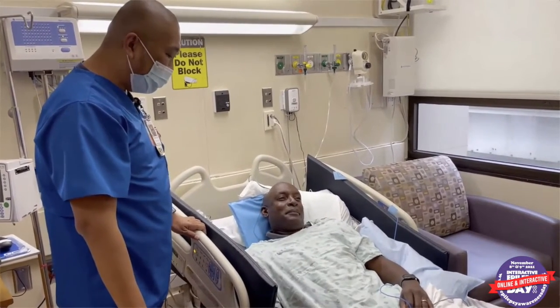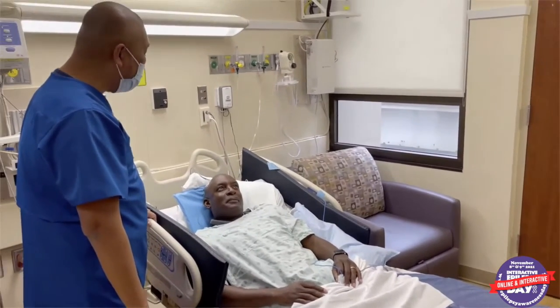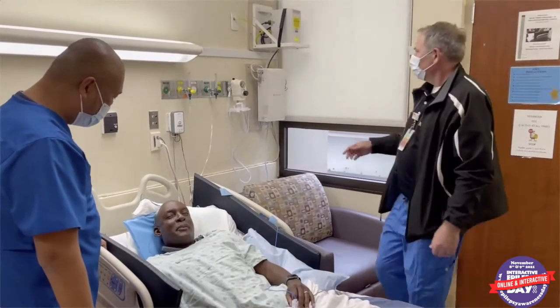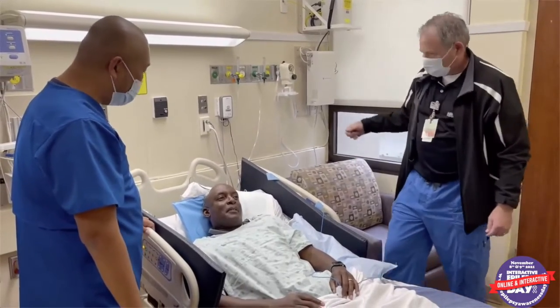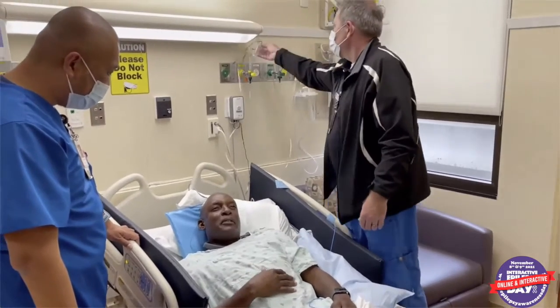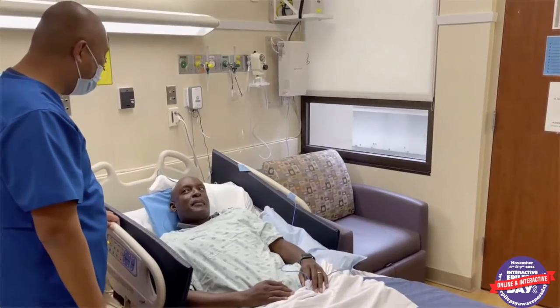Steven. Hey, Steven. How are you doing? You know what happened? You had a seizure, okay? You know where you are right now? Do you feel any pain? Do you feel any numbness, tingling? Feeling nauseous, okay. All right, well, no, I'll refer you to the doctor, see what's up and see what we can help you with, okay? All right.